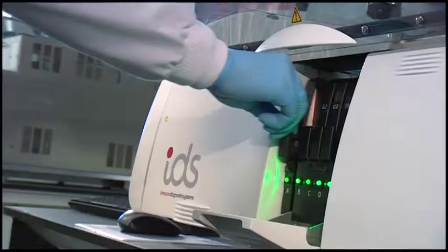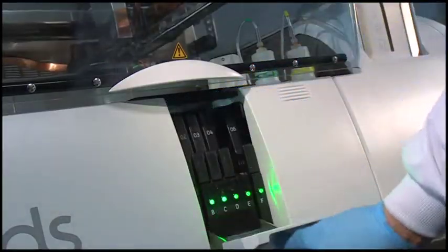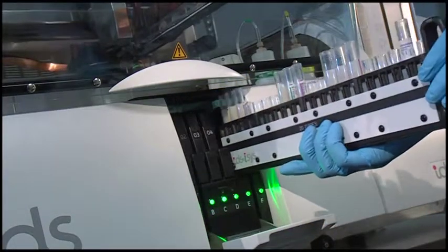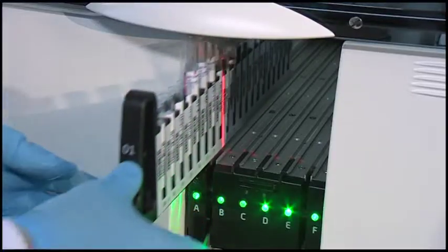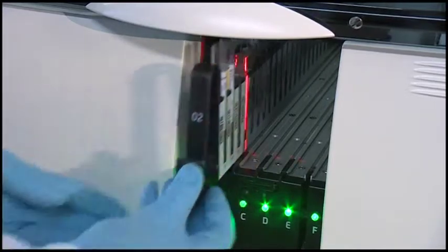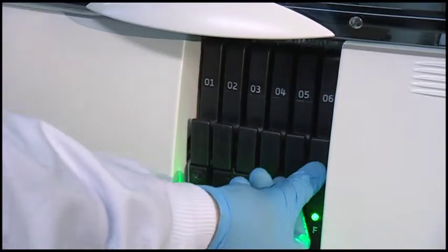The 120 position sample loader can handle a wide variety of primary, secondary, and pediatric tube types for samples, calibrators, and controls. Continuous loading and random access to the samples allows the flexibility to load and unload samples at any time, further increasing productivity and throughput.